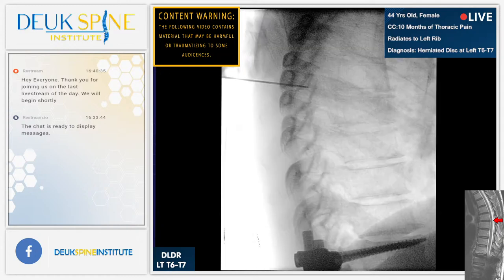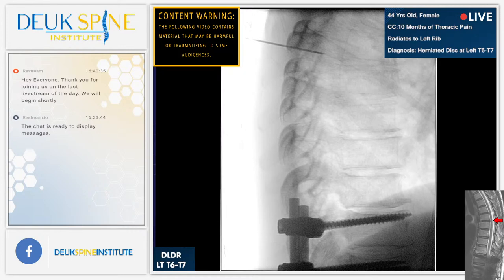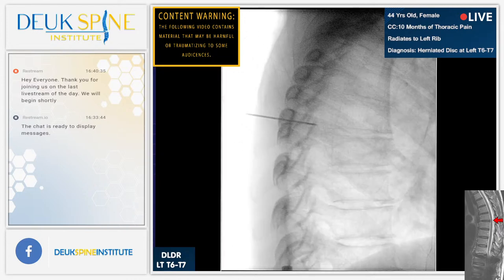Good job. Take your time, Jordan. We've got plenty of time. You need to move the whole machine further north, a little bit more north, and then we've got to wag it into place. I think your wag is not horrible, but your orbit is off by about a degree and a half to 2 degrees. Give me some orbital change.